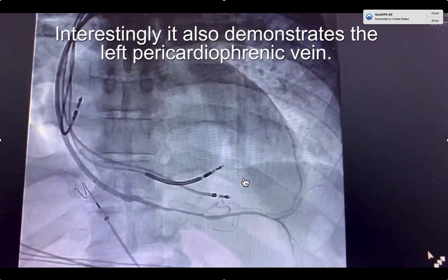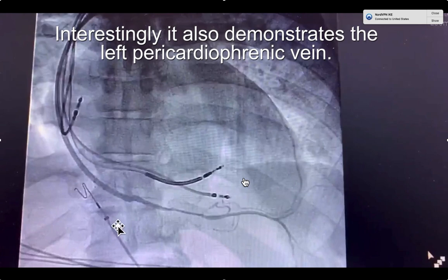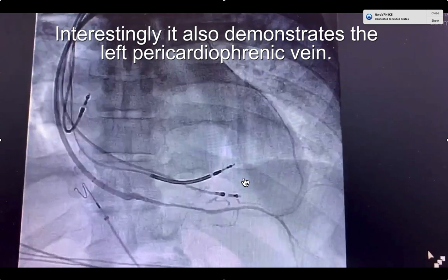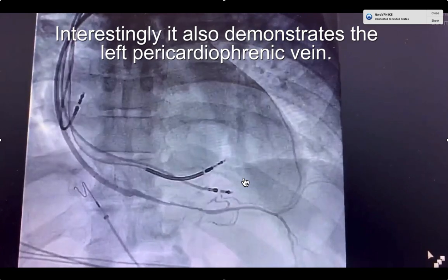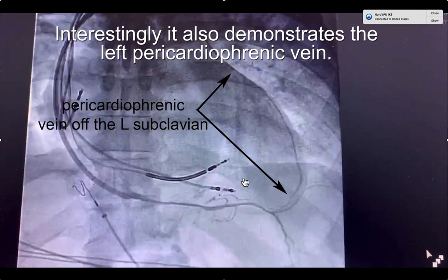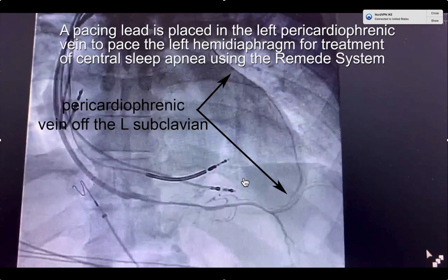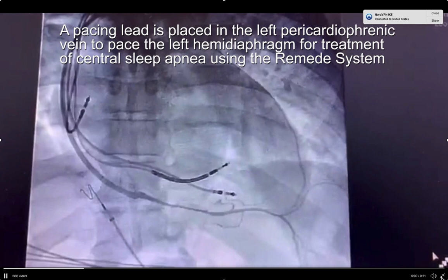Interestingly, it also demonstrates the left pericardiophrenic vein, and this is something that electrophysiology physicians are going to become more aware of in the future.